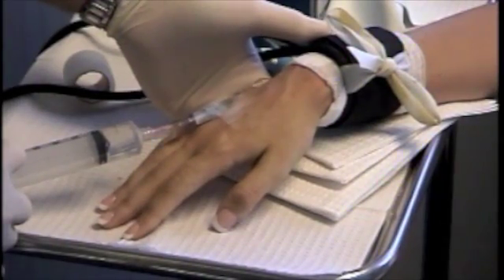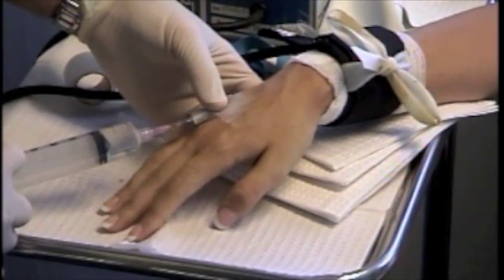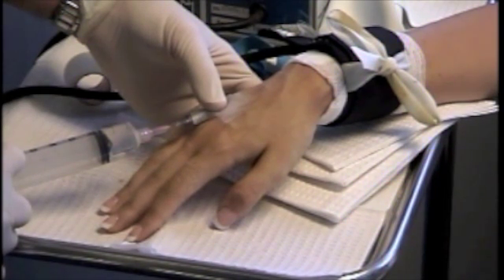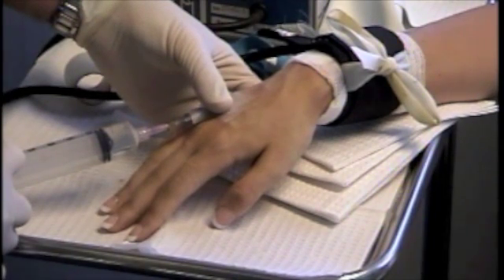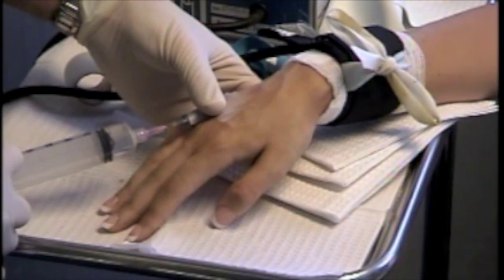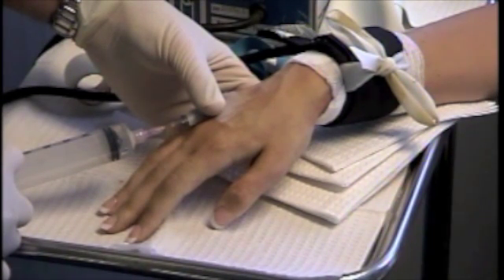As you can see, the blood vessels are expanding. I'm checking to make sure the tourniquet is tight so that the xylocaine stays in the hand itself. I found that the slower you inject, the less pain the patient has, and this patient has been coming back to me for several years and is happy with the technique as well as the results — being pain-free from the injections. The injections need to be made with a very, very small needle. I use many syringes since I want the needles to stay sharp to penetrate the skin as easily as possible, similar to the small needles I use for underarm axillary injections for hyperhidrosis, changing needles frequently to prevent any pain.